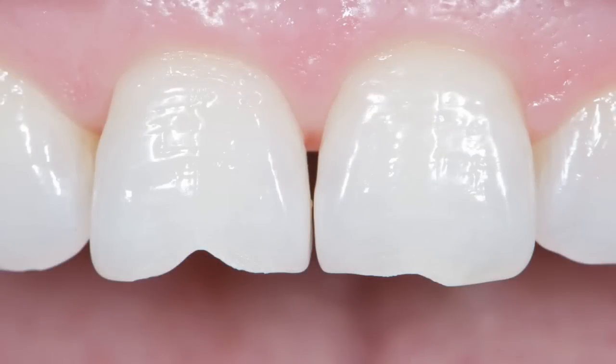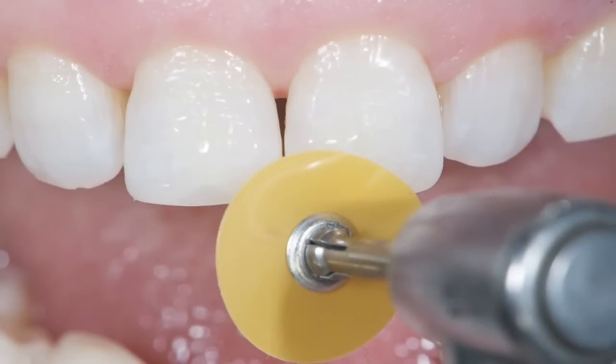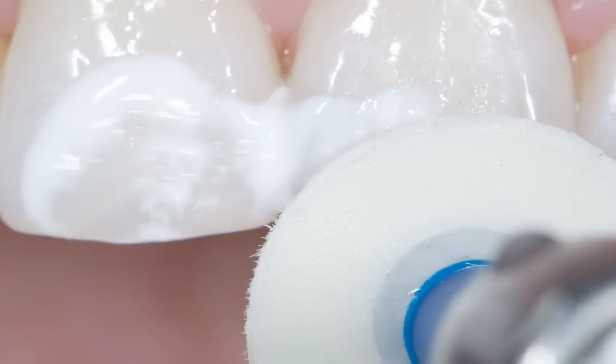Here are the preparations — basically a slight bevel. I don't really like to prepare these types of defects a lot; I give them a little bit of a bevel and that's about it. Generally I do these without any local anesthetic. These are photos showing the process of polishing the restorations. In this case, I polished with the SoftFlex XT discs — I like the XT discs because of their flexibility. Then I used FlexiBuff and Renamel's Enamelize Polishing Paste, which I generally use on microfil composites, to compare how it maintains its polish over the years.